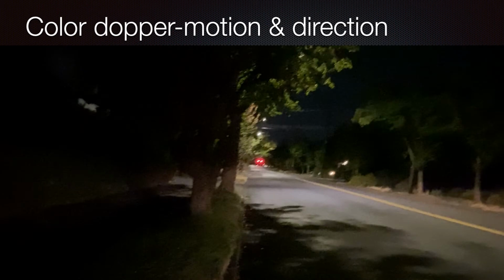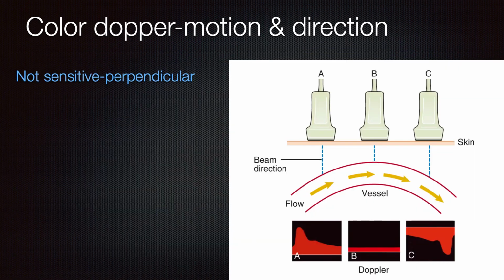So this factor is because the sound that's coming out from the cars to me is actually a higher frequency as the car approaches me, and then it becomes a lower frequency, and that changes the tone. And this is important in noting Doppler shifts. So here you can see blood flowing towards the probe in A. It has a Doppler shift.